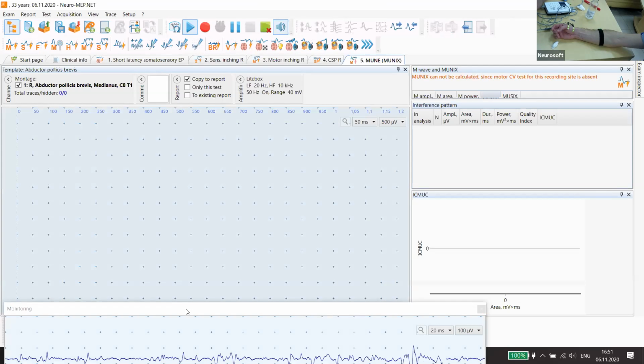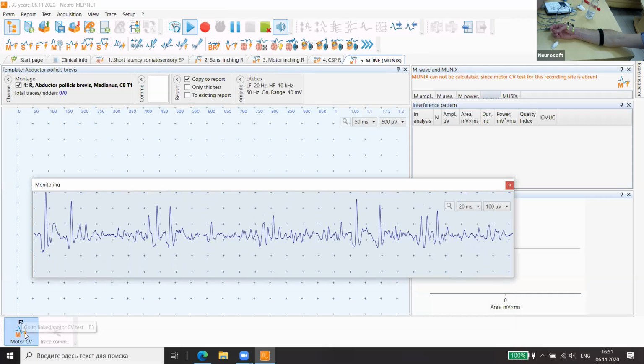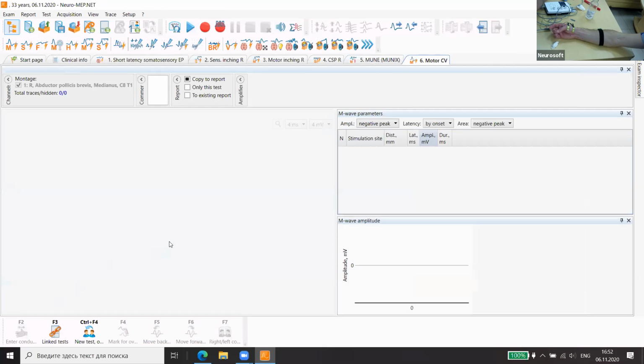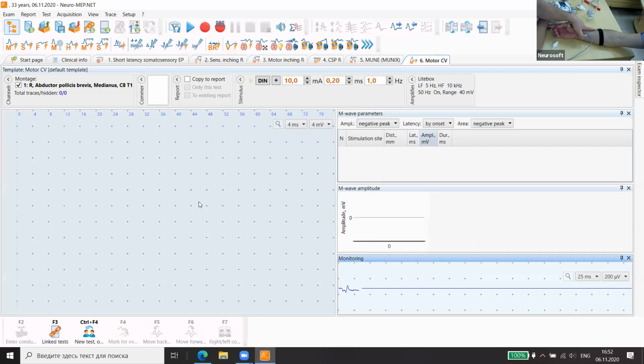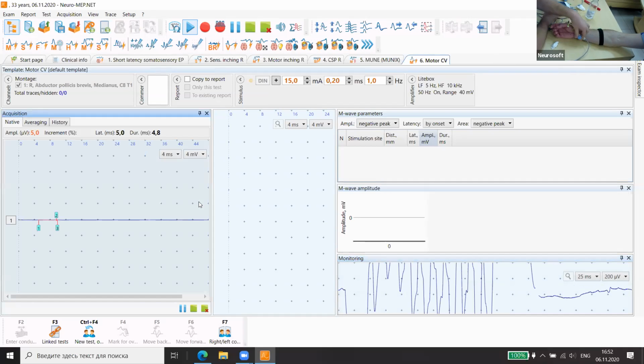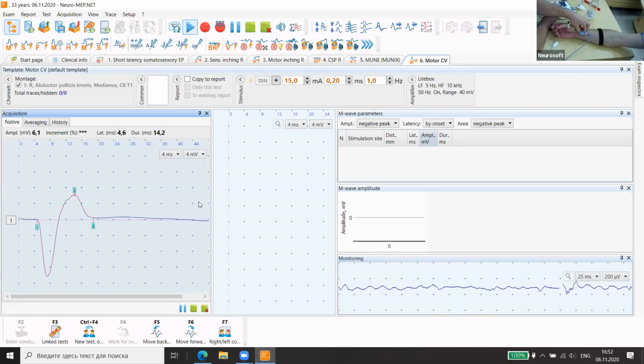First of all, we need to go to the motor nerve study and do it. Wait, I change.